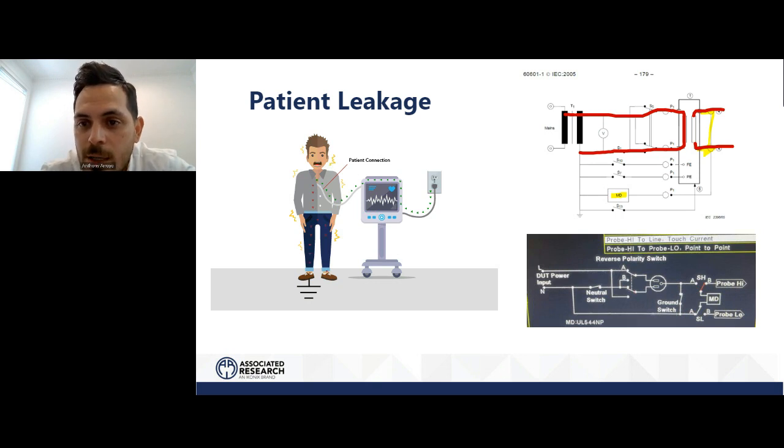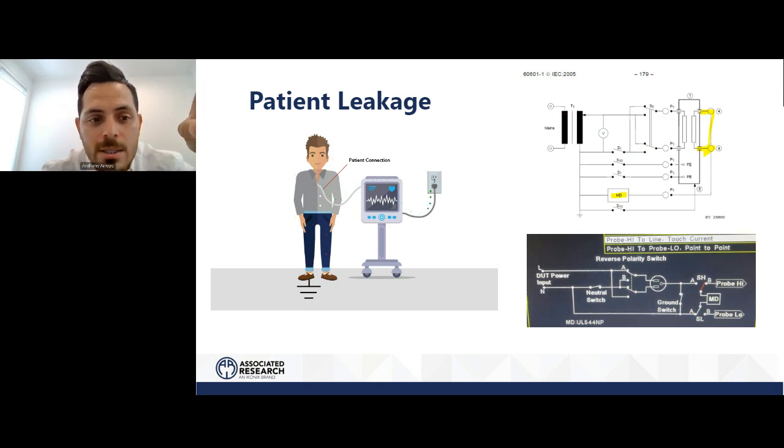And then here we have a functional earth and your ground circuit, right? So it should be very understandable. And then our fault conditions. So in case that wasn't clear earlier. And so now, where is our MD located? Let's describe, this picture tells you, right?